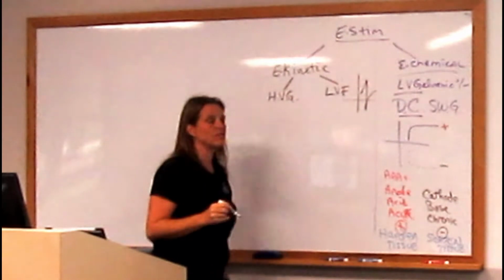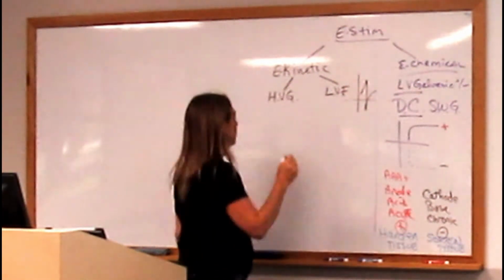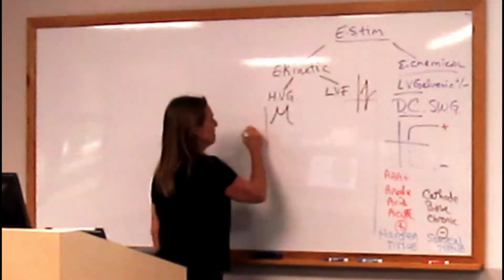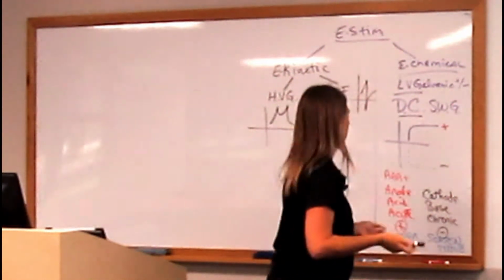Now this one's interesting because it's got the G as in galvanic, but they found that because the HVG comes out as a double peak, it does not cause a galvanic reaction or ion collection.